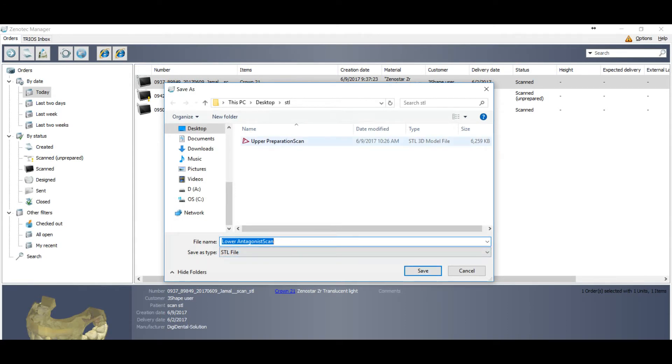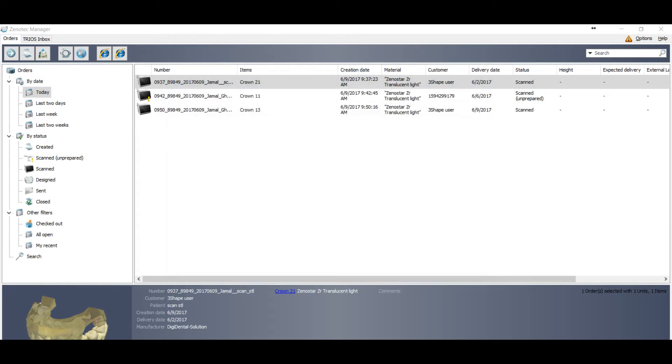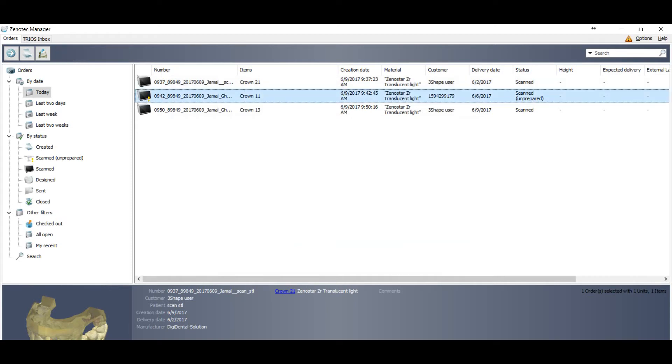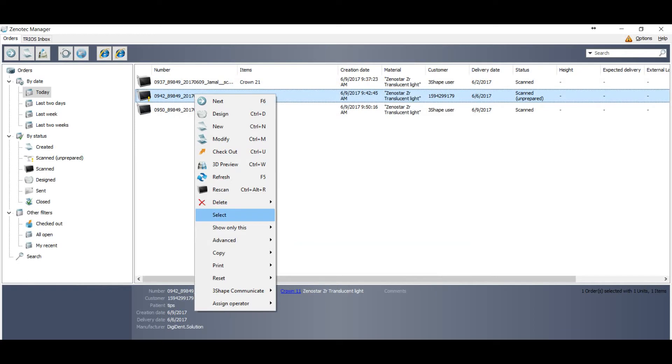So you can just select STL and save it. And it's open again for the lower file. You can save it. You can see your upper file already saved, and then you can save the lower file. So this is the easiest way.